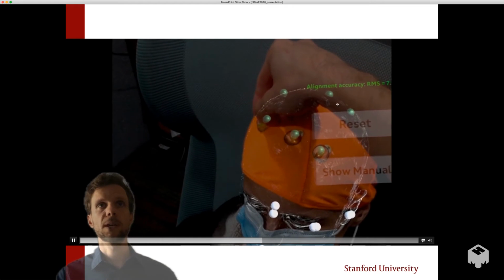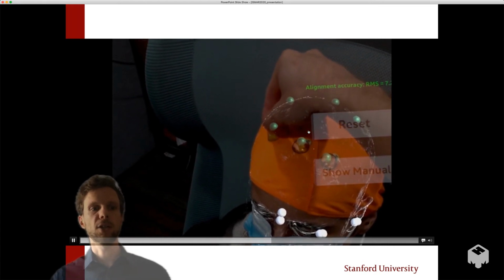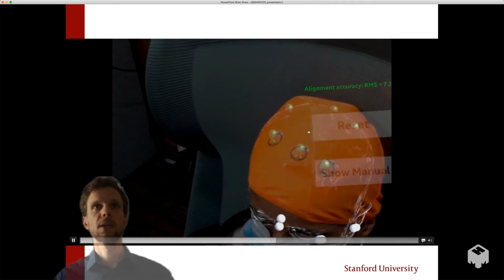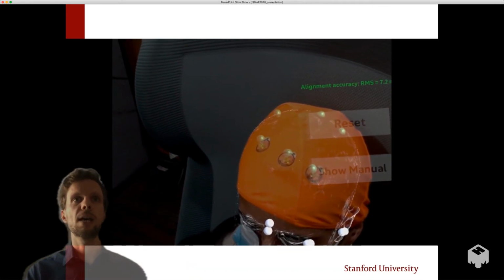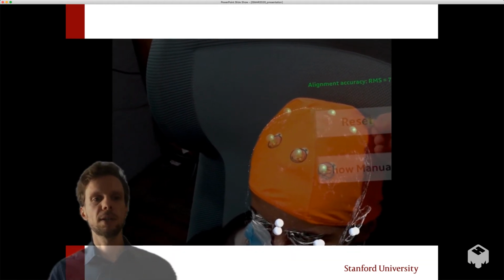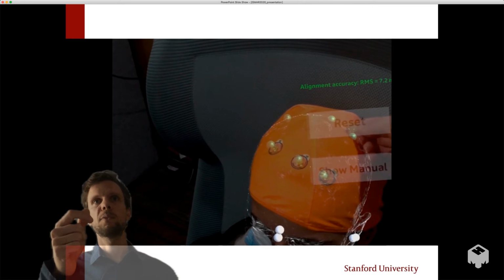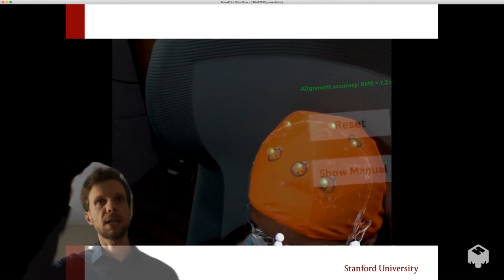In green, at the top of the head, we furthermore see the virtual targets on top of the subject's head. The user now takes MRI visible capsules, these are little vitamin capsules, and places them at exactly the locations where he perceives these virtual targets.